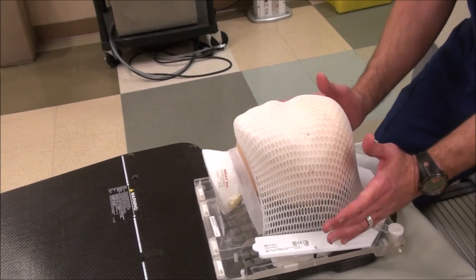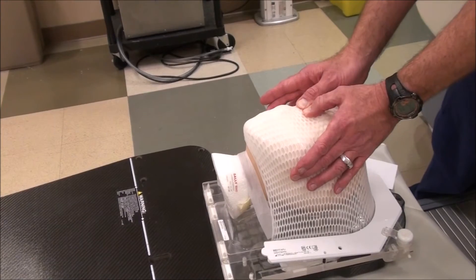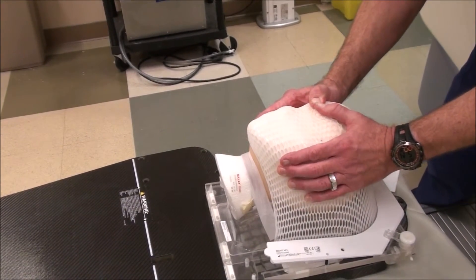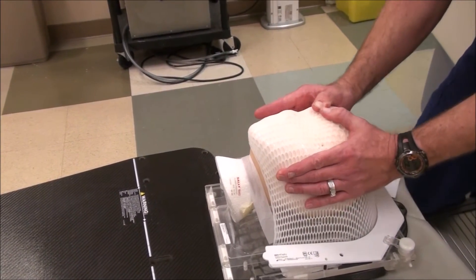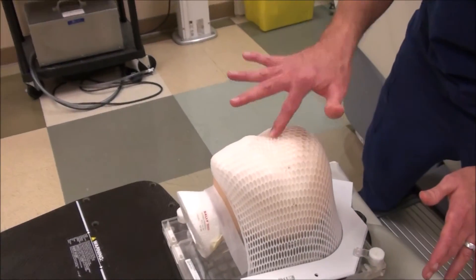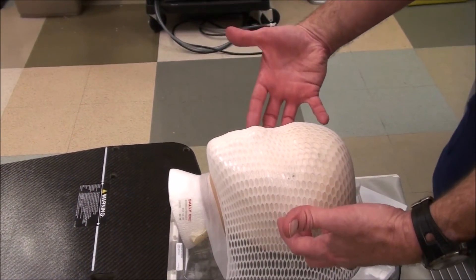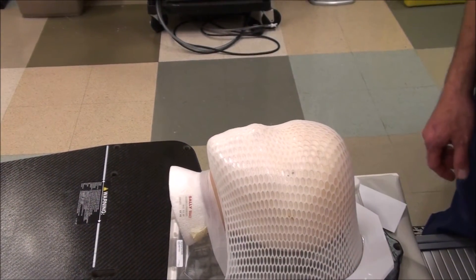When you get the mask on, what I do is just kind of rub my finger up to the top right in between their eyebrows — don't poke them in the eyes, it's easy to do. You kind of slide the thing up and down into the nasion so that you get this nice groove right here, and you're going to kind of pull up on it a little bit too. Don't squeeze their head — pull up this way. It gives a little bit of stretch so that it drapes over their face instead of smashing their face back toward the headrest.